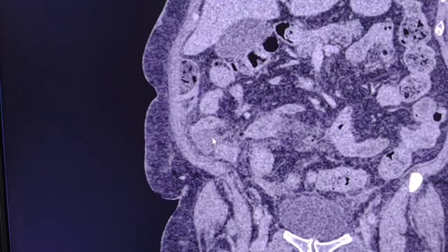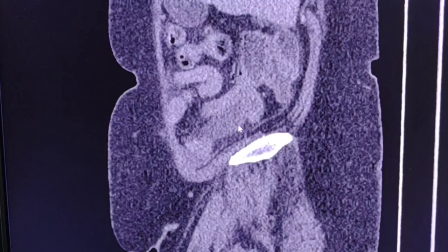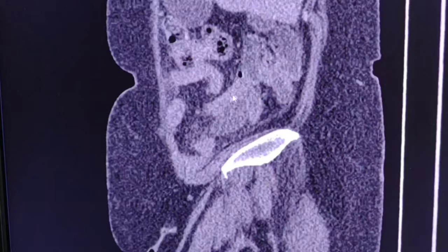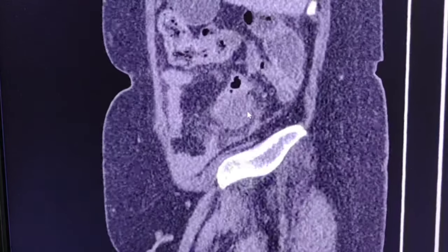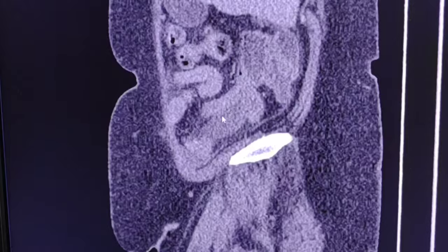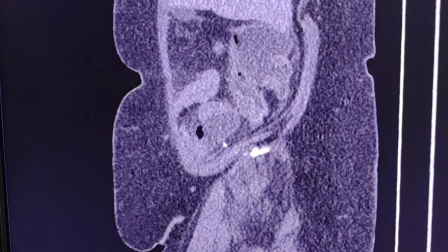In the sagittal view, this area is the collection and here is a bowel loop. There is some separation, not very easy to identify.